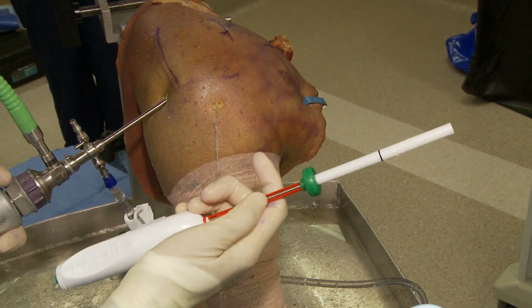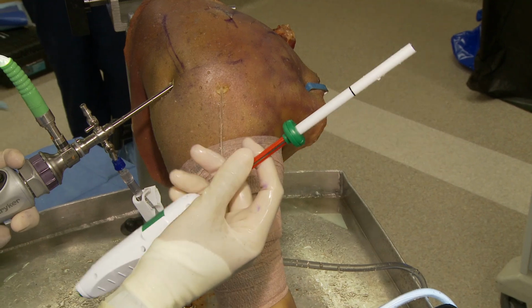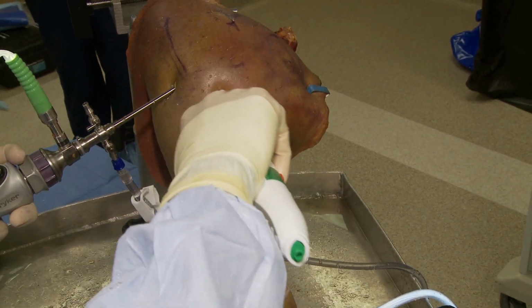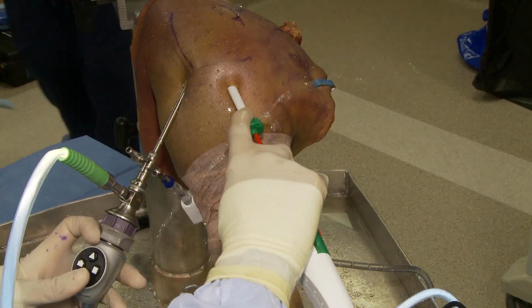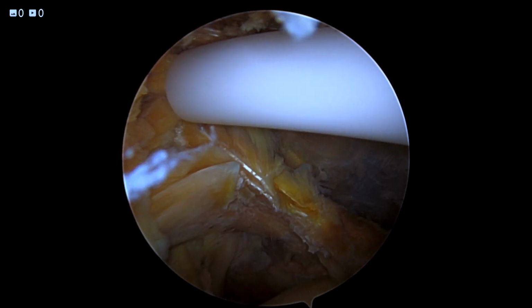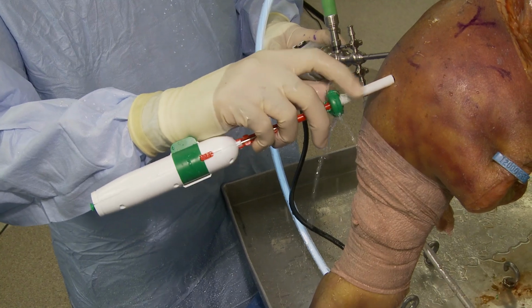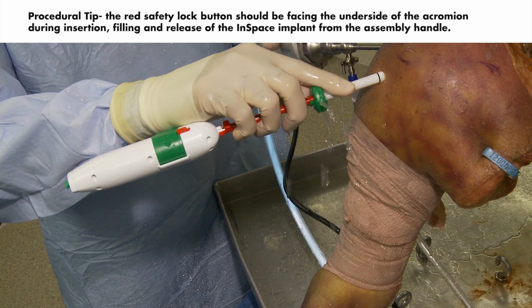Remember that as long as this red backstop is in place, it will prevent you from prematurely exposing the device. So we're gently inserting the device into the subacromial space. If you do encounter bleeding, it's generally minimal and can be controlled using a standard radiofrequency device or adjusting the pressure on your pump. It's also helpful to ask your anesthesiologist to maintain the blood pressure as close to a mean of 100 as possible.